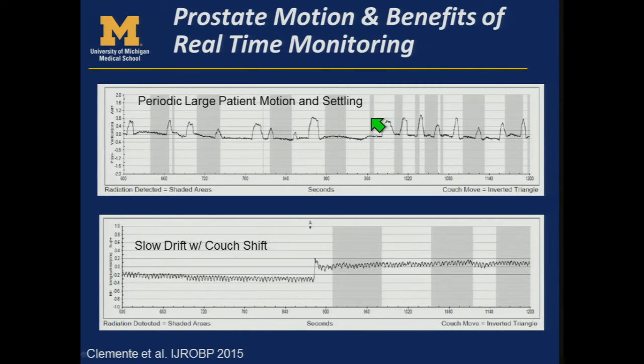One of the benefits of real-time monitoring for prostate, SBRT, or conventional is that you see a lot of different types of motion for prostate patients. So this is an example from that paper that I mentioned before with periodic large motion, and then the patient settles in. The therapist didn't need to move the couch at all, but they're tracking the patient.